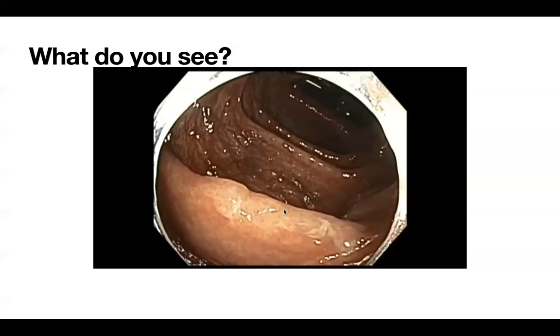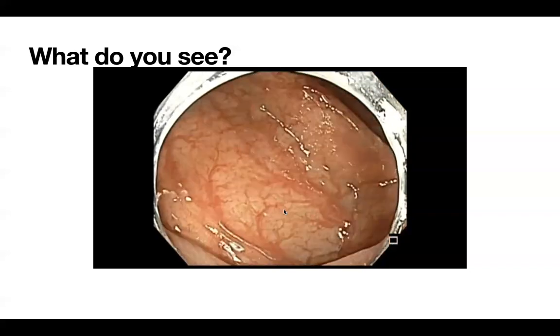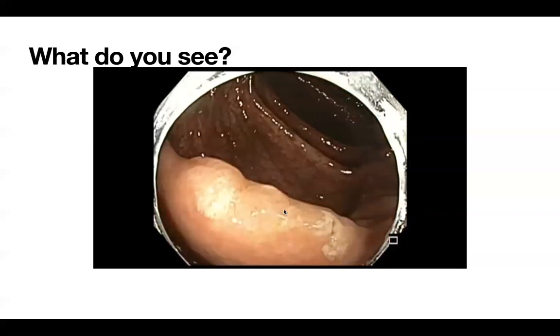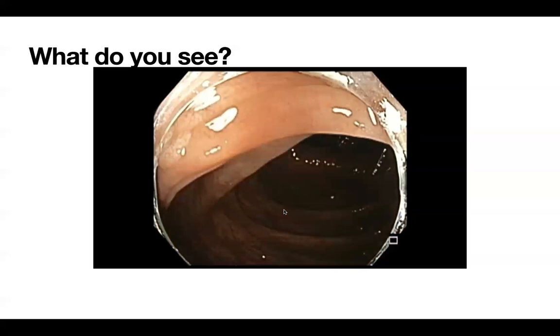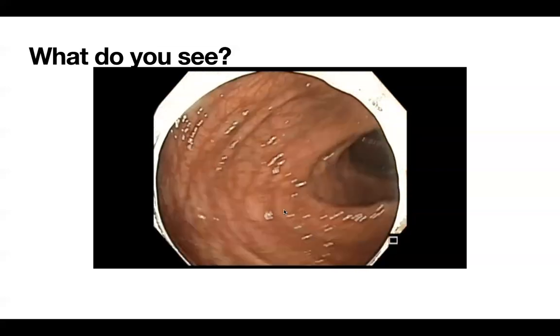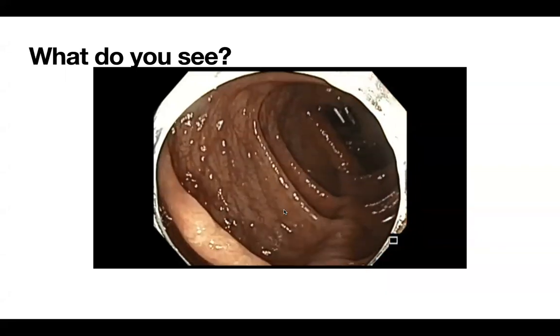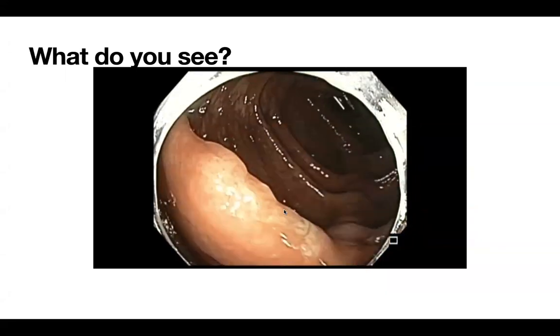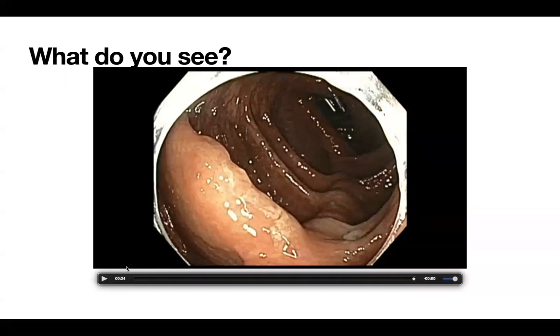Right. So here is the polyp. It looks a little bit different from what you saw there after washing. And maybe Sriram could comment on this. So you can see here, right, I kept slipping back. For the sake of our session, I actually eliminated quite a bit of video where I struggled to maintain that position, but I just wanted to show you a little bit.